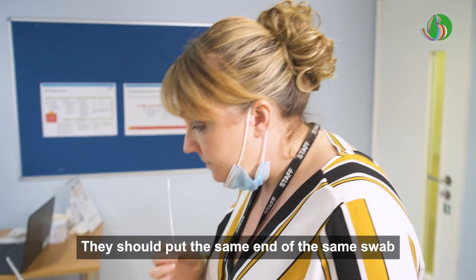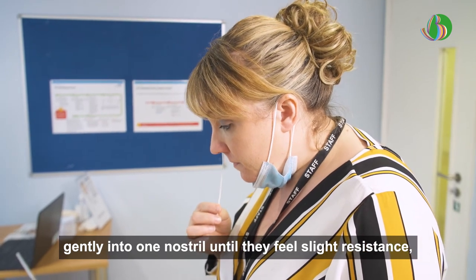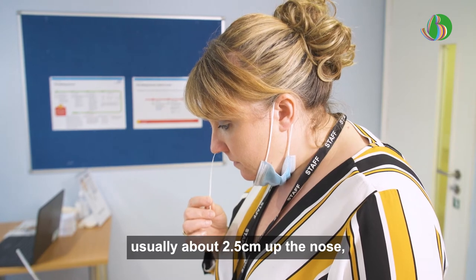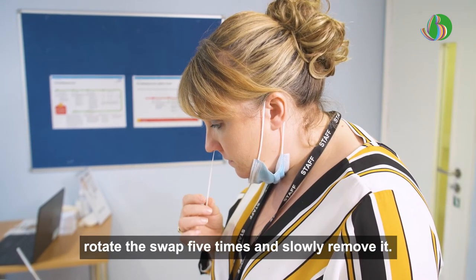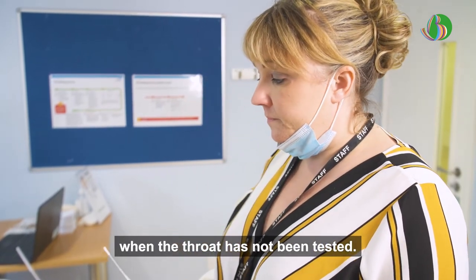They should put the same end of the same swab gently into one nostril until they feel a slight resistance, usually about 2.5 centimetres up the nose. Rotate the swab five times and slowly remove it. They only need to sample one nostril, except when the throat has not been tested.